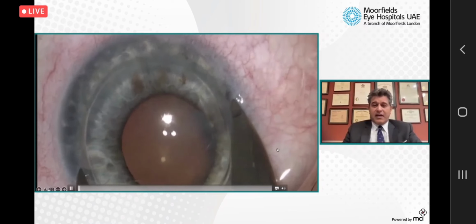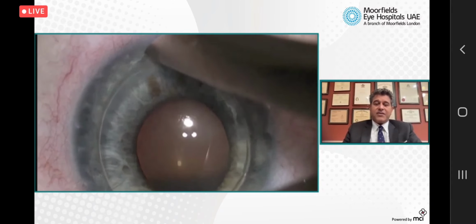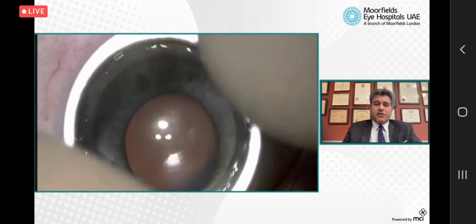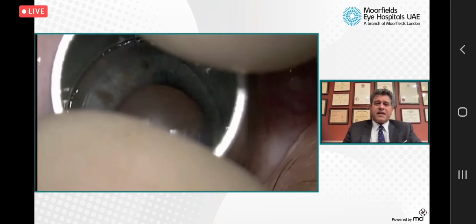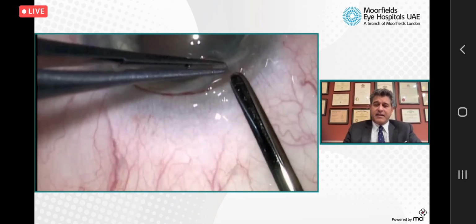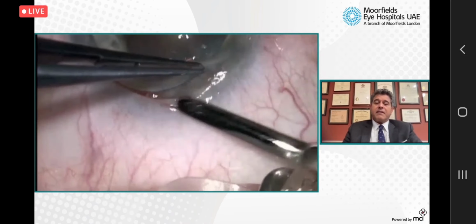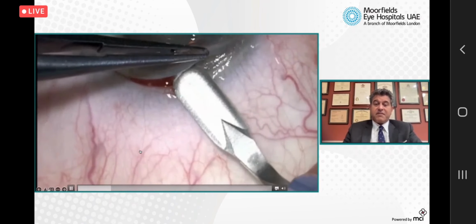And this is the video which illustrates the procedure. We measured up the size, and we used a trephine to trephine the periphery outside the area that was thin. I'm going to move this along for the benefit of time. Well, here we have trephining the cornea, not to full thickness, to partial thickness. And once that's accomplished, then we dissect towards the graft-host interface. I'm using one of Melles's dissectors here that's used for anterior lamellar keratoplasty, and just very, very gingerly removing and separating that lamellar bit of tissue. We do this all the way around. I'm using a crescent here because there's a bit of fibrosis there.